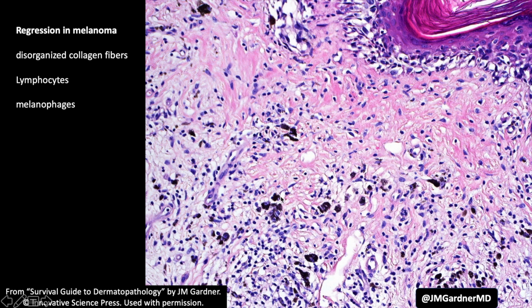I would call this melanoma in situ, lentigo maligna type, with abundant dermal regression. So basically, when I see a lot of regression, that means there could be invasion that has gone away or that we've not sampled, and they should think about that and keep it in mind. Some people have advocated for measuring the depth of regression. I personally do not like that idea or do it, but I have met other people who do, but I don't do it in my practice.